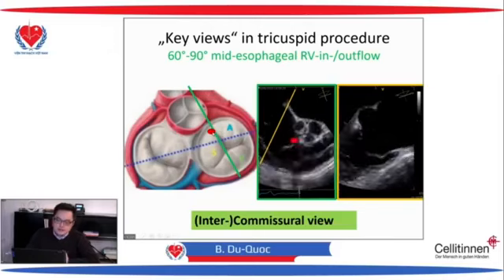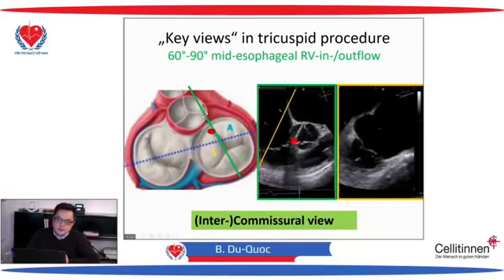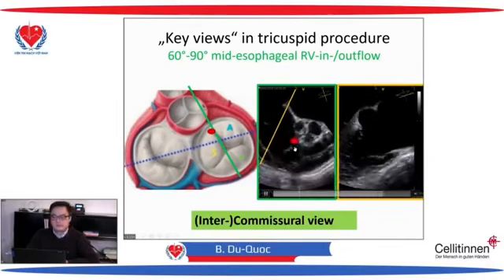As you see, this commissure points to the aortic valve, and especially it points to this commissure. This is the non-coronary and the right coronary cusp. And you can see it nicely in this picture that this point is exactly this point. This must be the anterior commissure.